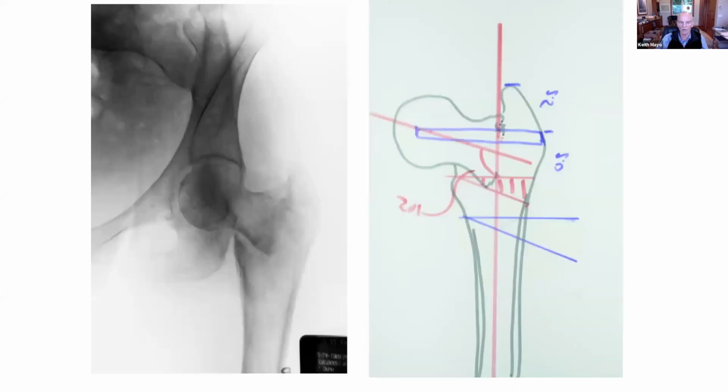All right, so this is a complicated case. This is a guy that had multiple embolic strokes. He had a femoral neck fracture on the right, which had been managed initially with a bipolar, which dislocated, had been revised. And then he had another fall and the femoral neck fracture on the left. And they said, well, leave him alone. He should be able to at least do transfers. Well, he wasn't able to transfer. And so he ultimately came to us without a normal side as a template.